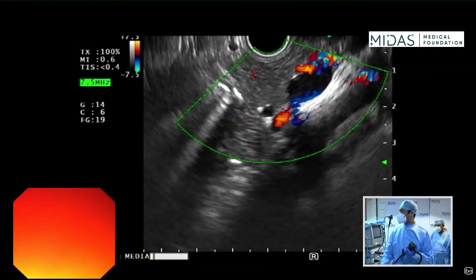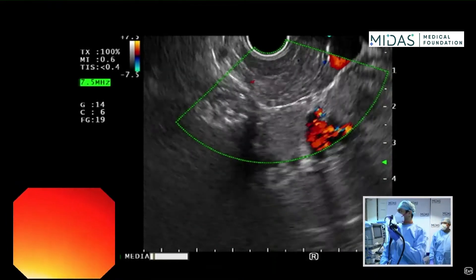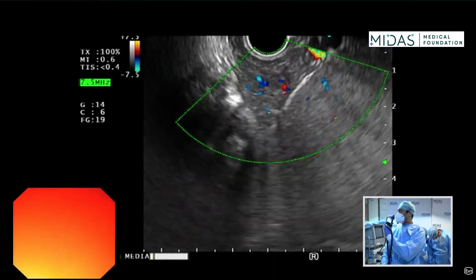Again, counter-clockwise and then clockwise all the way down through the pancreas, kidney, tail, and spleen.